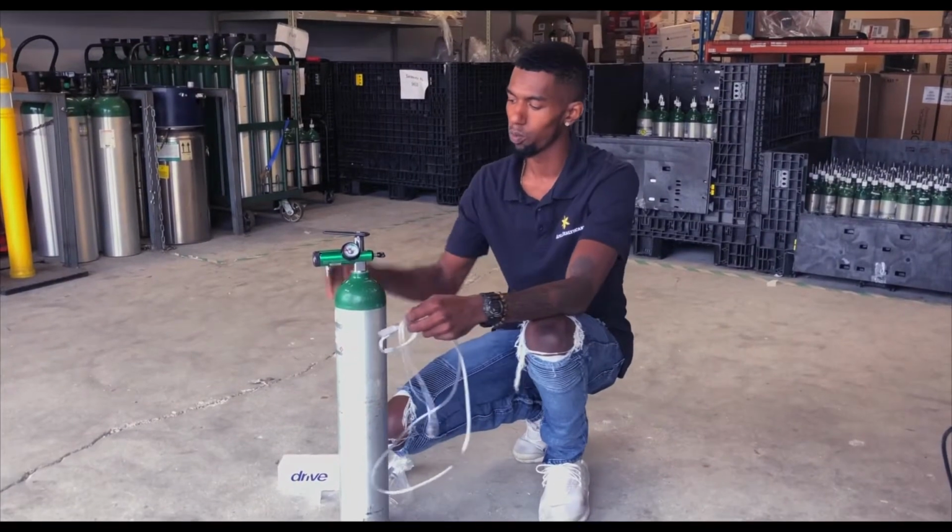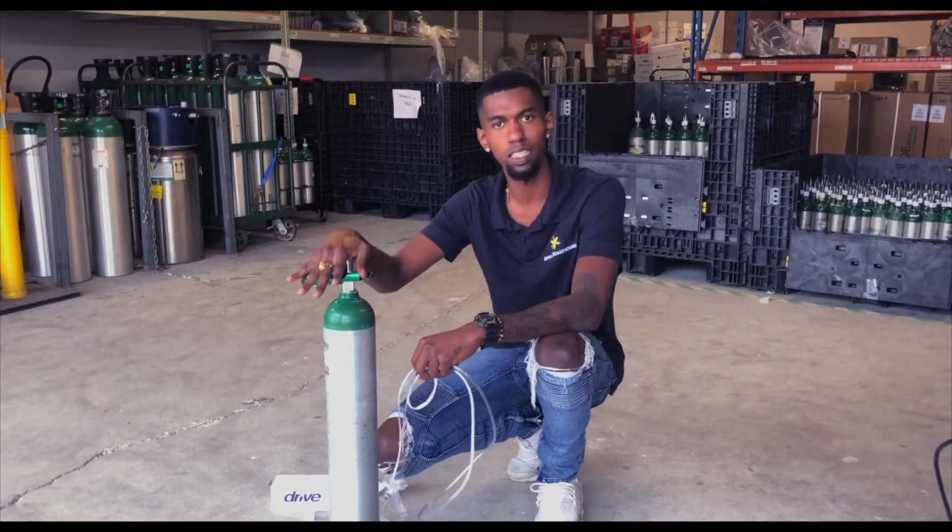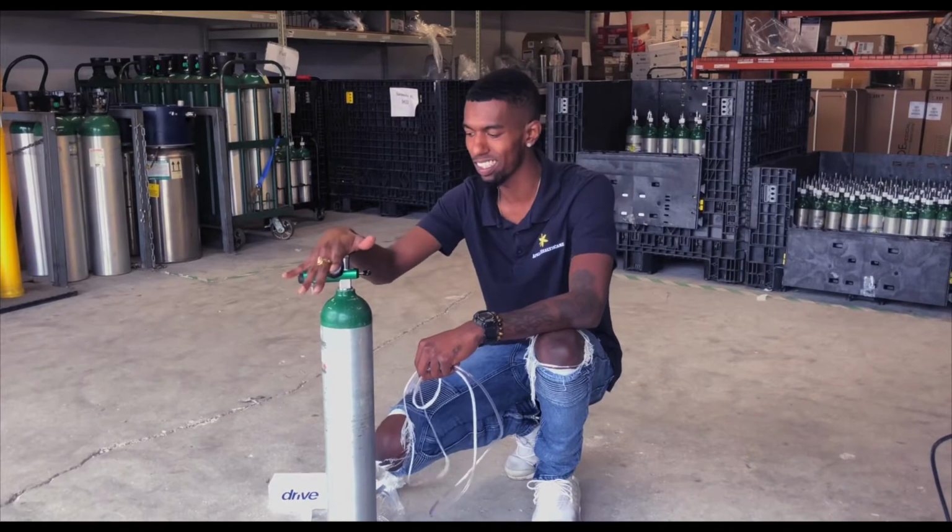Alright, so we have our regulator connected to our E-tank. We have our key ready to unlock all the oxygen that's in there.